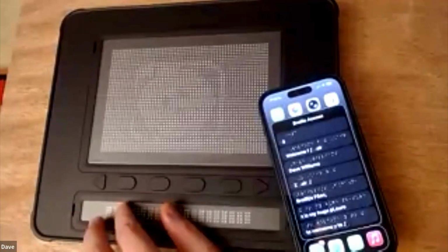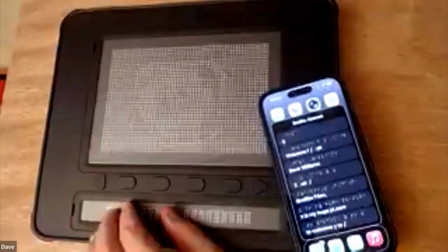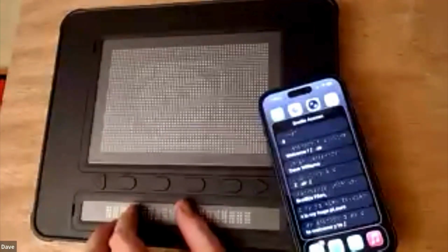Now, nothing will be happening on screen because, as I said, this is a Braille first experience. Actually, on screen, we're still probably focused on our settings icon. And if I were to touch my iPhone's touchscreen, I could still operate the phone in the normal way.